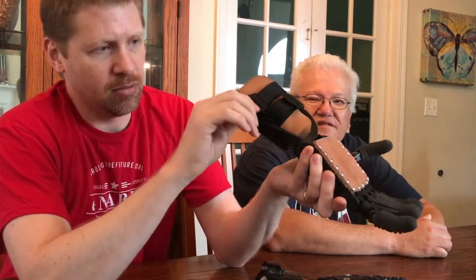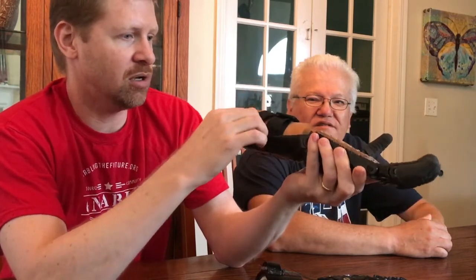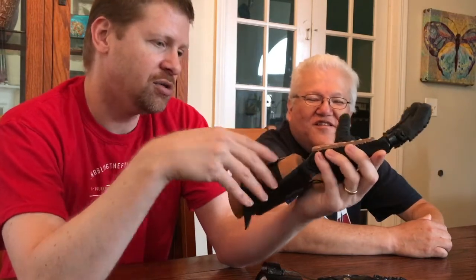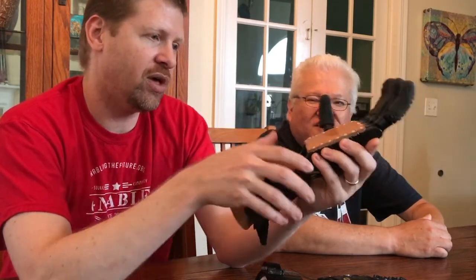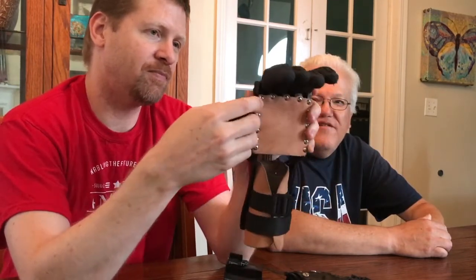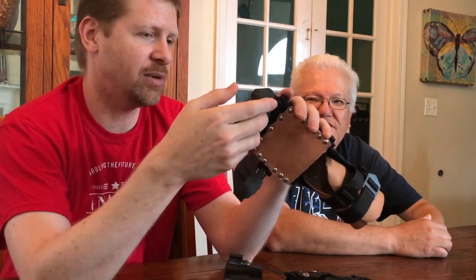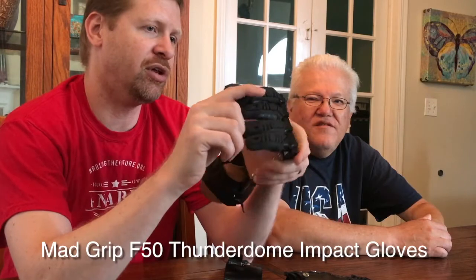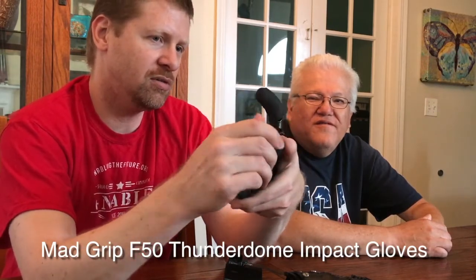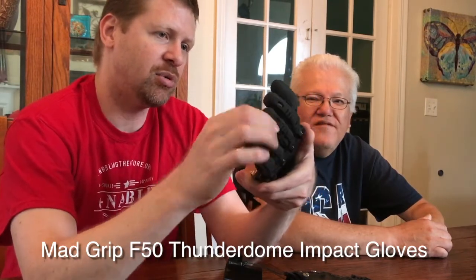It also uses straps with buckles — are those easy for you to put on one-handed? Good. So a couple of buckles to put that on, and then we've put some rubber on the fingertips. These are actually from gloves that we bought online — I'll include the link with the video. They're rubber grip gloves that we cut the fingers off to provide a better grip.